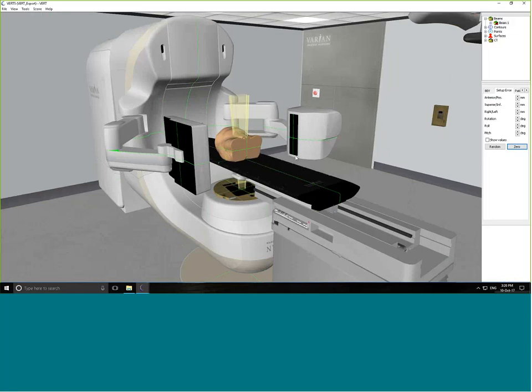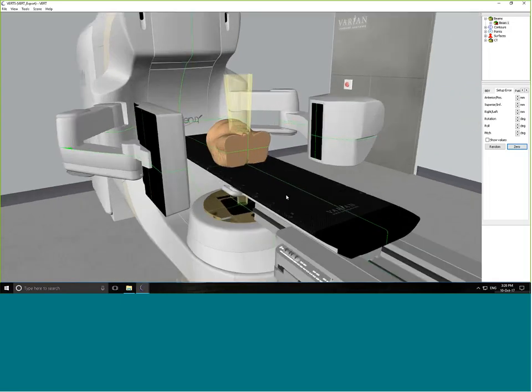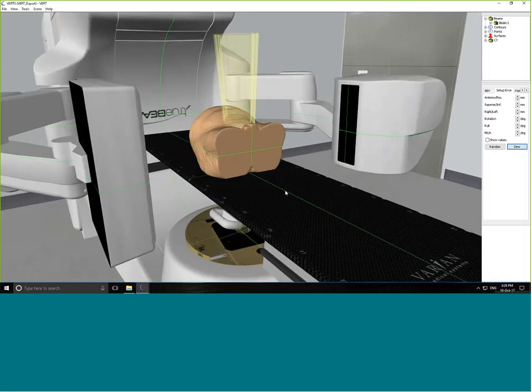There's a lot of things that I just wanted to point out. First of all, I wanted to thank the development team for all the work that's gone into this. It's been a huge project for us here at Virtual, getting this online, and the amount of work that's gone into it has been quite incredible, really. There's been a few barriers that have delayed this slightly. Obviously, the knowledge transfer with the development team, and they've got a whole new, brand new DICOM loader. The way that the patients are now loaded, the DICOM is loaded into VERT is completely different to VERT 3.1, and that took a good chunk of time to develop.